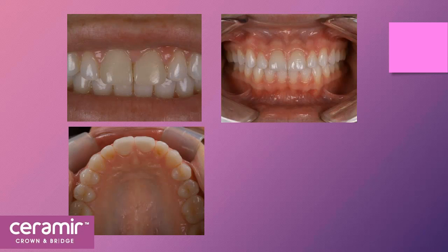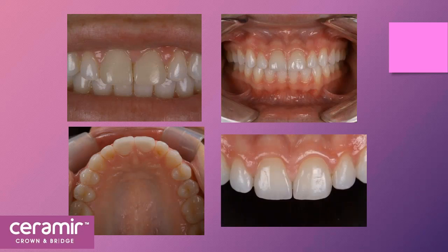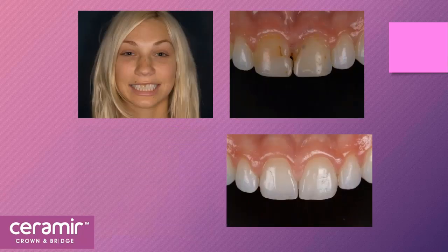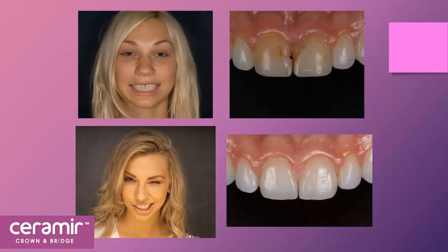So in this case, we've used the Ceramir cement from Doxa. It's a calcium aluminate. We've got great looking results. Look at the tissue, how healthy it is, how it's grown up in between there. The bioavailability, bioactivity is amazing on this product if you look at the research. So here's where we started. Here's where we set her up for success for the rest of her life. So we're thinking long term.